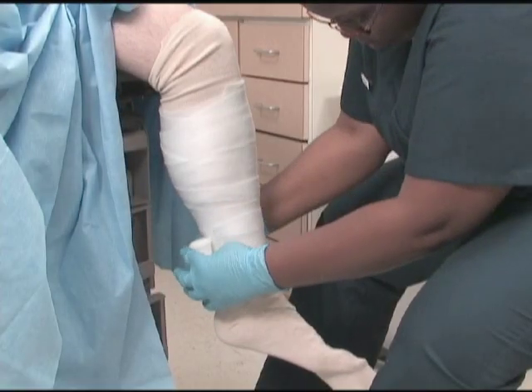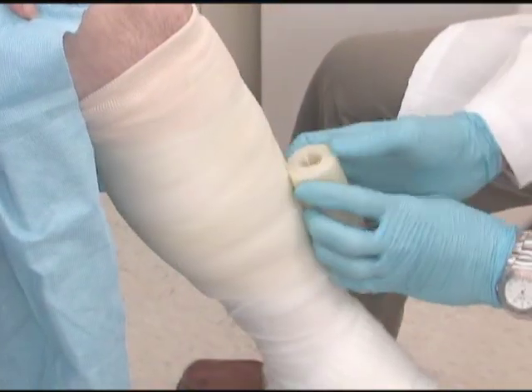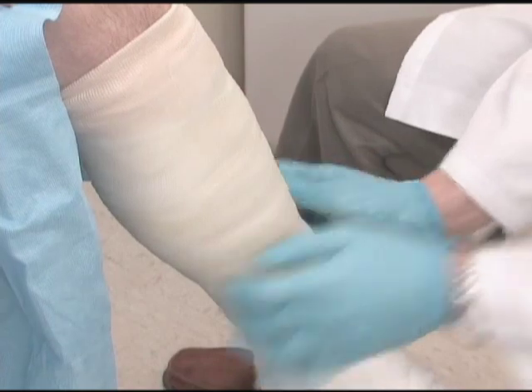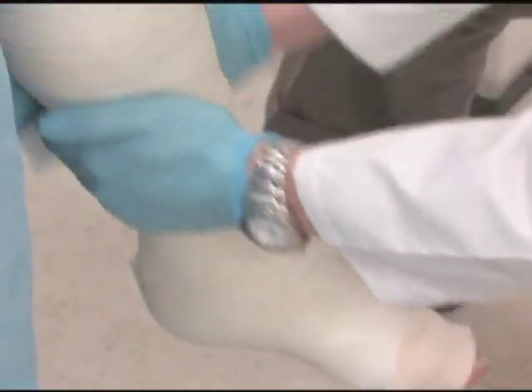Casts are solid, rigid, cylindrical casings that immobilize joints or body parts to facilitate healing. Casts are made from many different materials depending on the need. Fiberglass is a common cast material, as it is strong, lightweight, and waterproof.